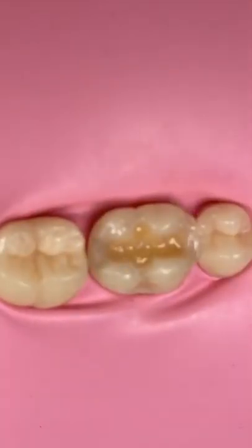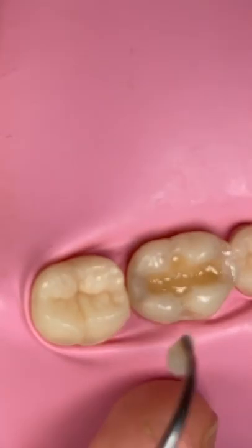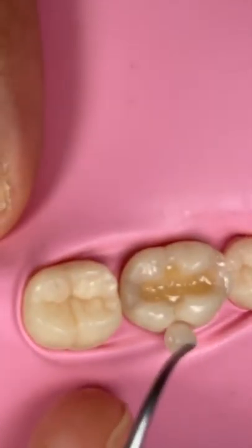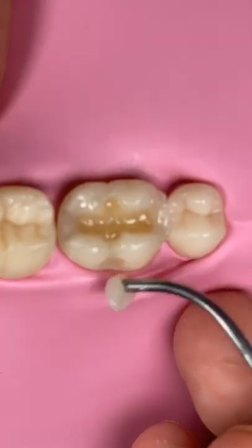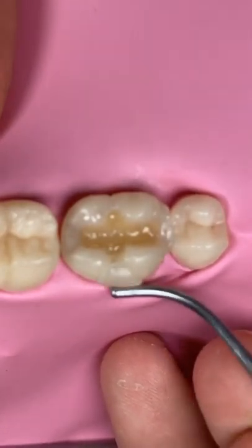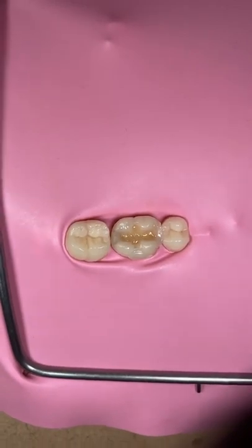Now time for the carving. Let's start with the enamel. I will restore the buccal first. Buccal, don't forget the buccal, because sometimes we forget about the buccal side. Take a big amount, yeah, make it roll. Don't forget, take a big amount of composite, and then press it gently. Ah, I think it's better, yeah.